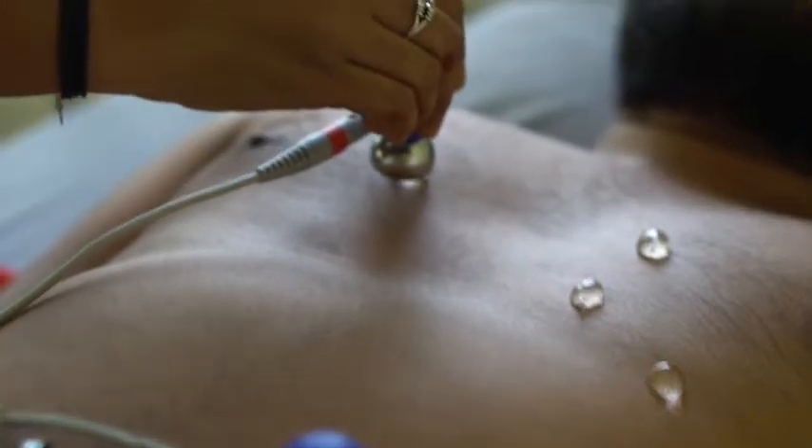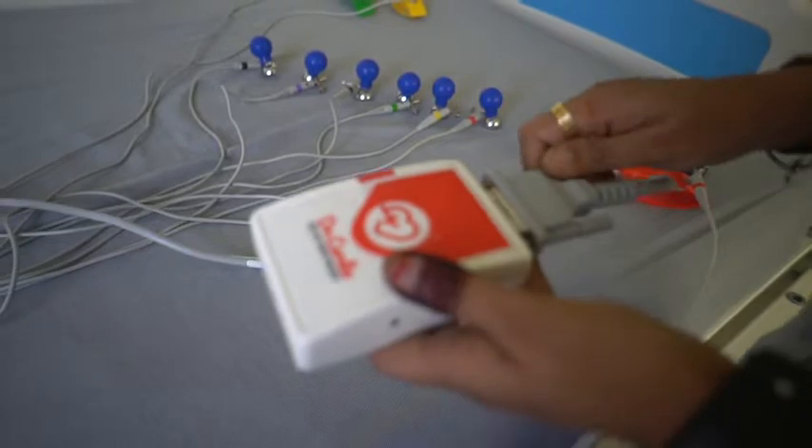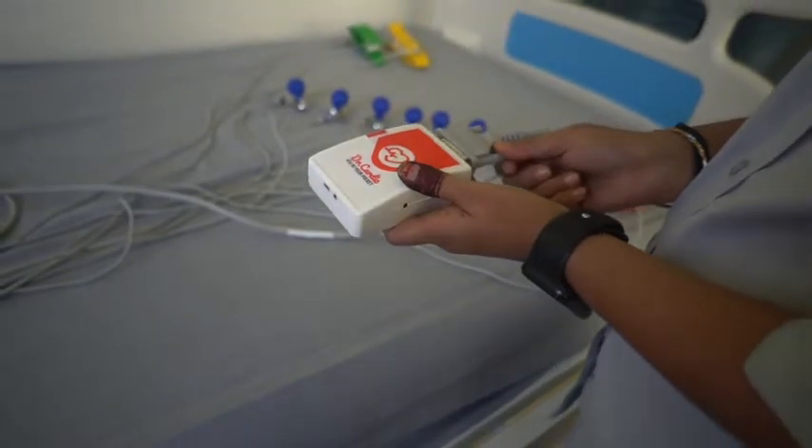Apply the chest bulb electrodes to the corresponding locations on the patient's chest. If you have not done so already, attach the other end of the ECG cable to the Dr.Cardio ECG device and tighten the screws.